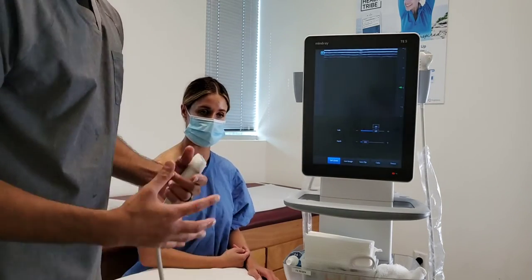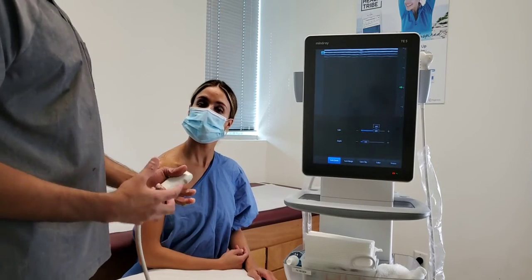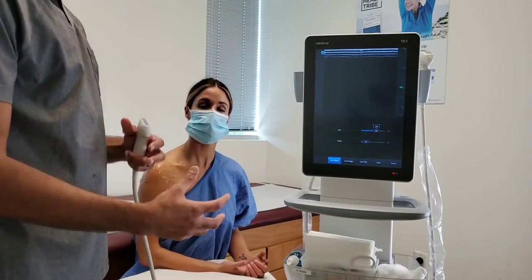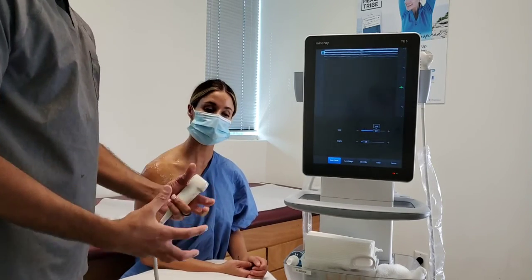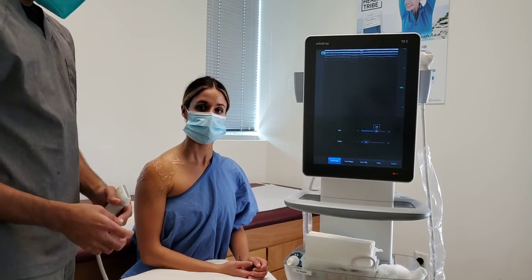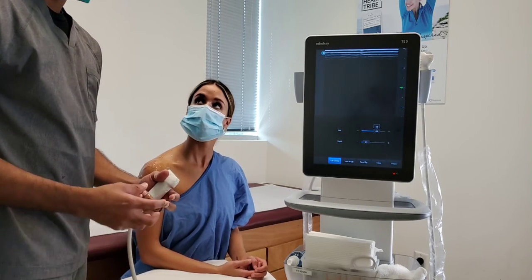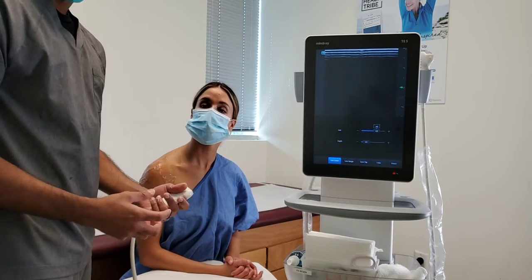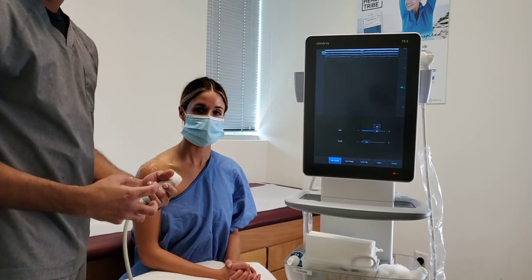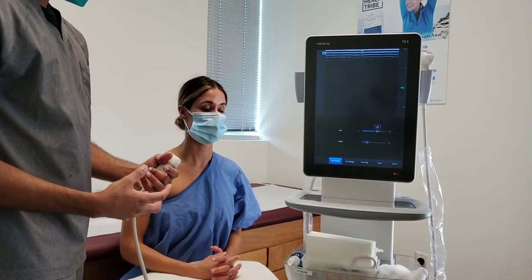So those are all the major structures to look at from a shoulder exam with ultrasound. There are other things that we can look at too. There are ligament structures, there are muscle structures, there are nerves, various different things, depending on what the musculoskeletal physical examination showed, is how I would determine if there's other things that I need to do with the diagnostic ultrasound. But as we saw, the ultrasound has its advantages over things like MRIs because it is more sensitive at looking at soft tissue structures like tendons. It has its disadvantages because we can't look deep inside the shoulder, although we can get hints at what's going on inside the shoulder with different views.